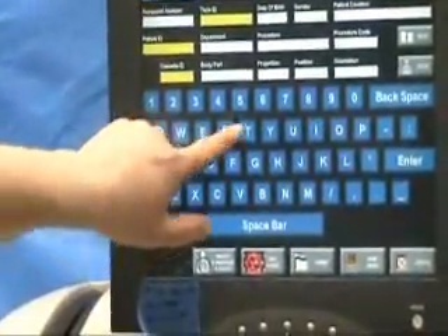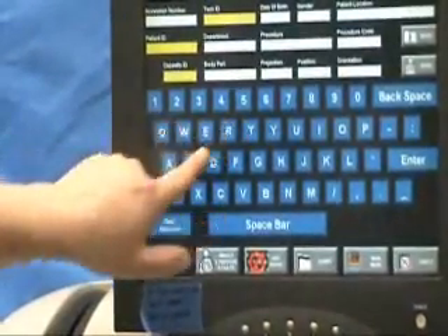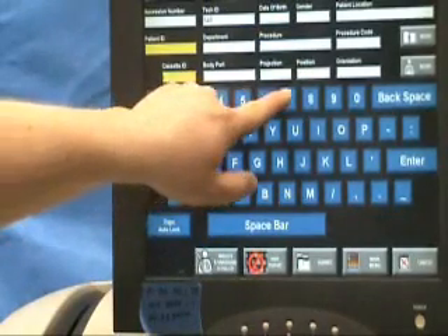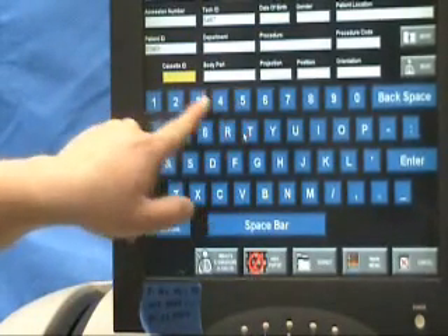First we need the birth date, exam type, etc. If the site supports a work list, this information can be entered automatically. If no work list is available, we can set up mandatory fields that need to be entered. After entering the patient information, we are now ready to run an X-ray.